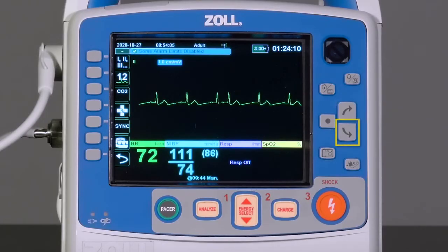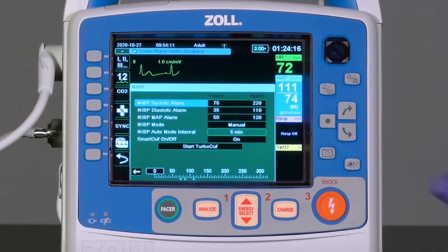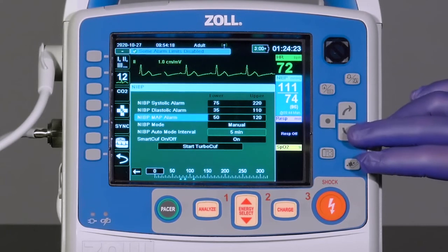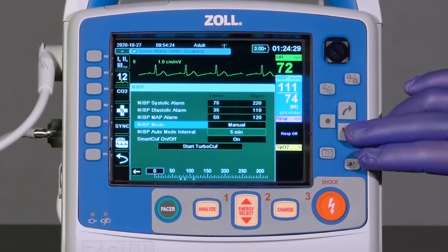Highlight and press the Select button to access the NIBP menu. In this menu, alarms can be enabled and disabled. Upper and lower limits for the systolic, diastolic, and mean arterial pressure alarms can be set. Either manual or automatic blood pressure modes can be selected.